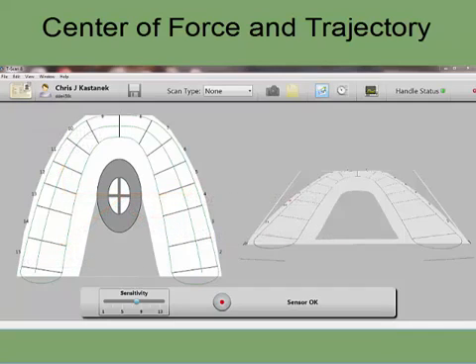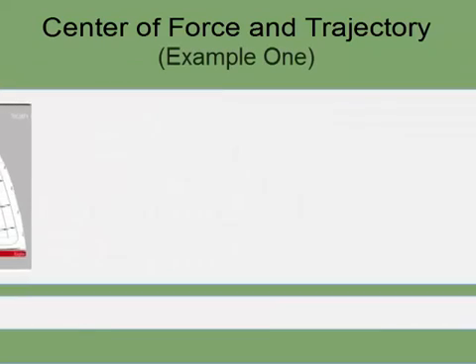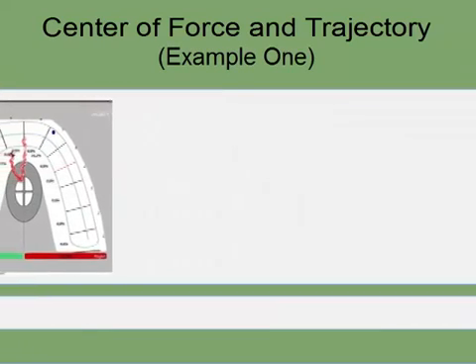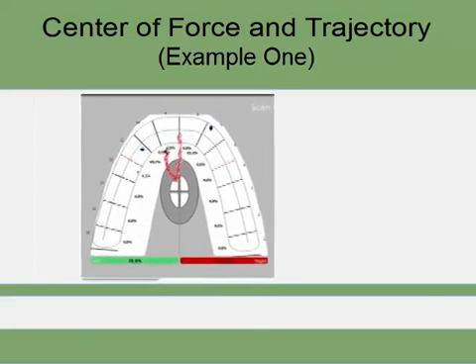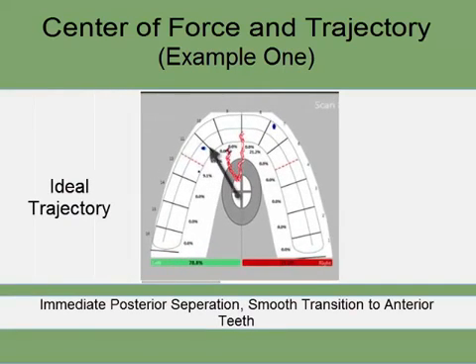Here are some examples of the center of force icon and trajectory during a left lateral excursion. The first example shows the force moving smoothly and directly towards the anterior left region of the arch, indicating immediate posterior separation and a smooth transition of force, implying good anterior guidance.